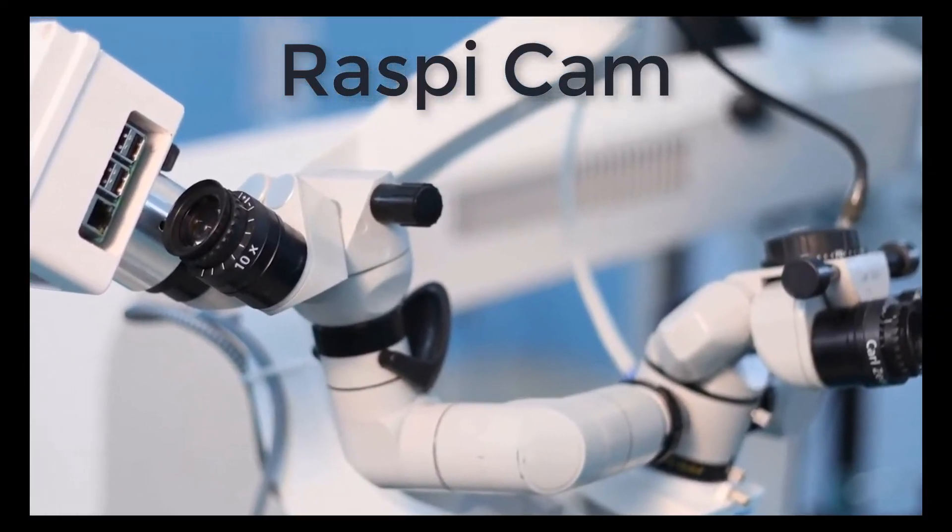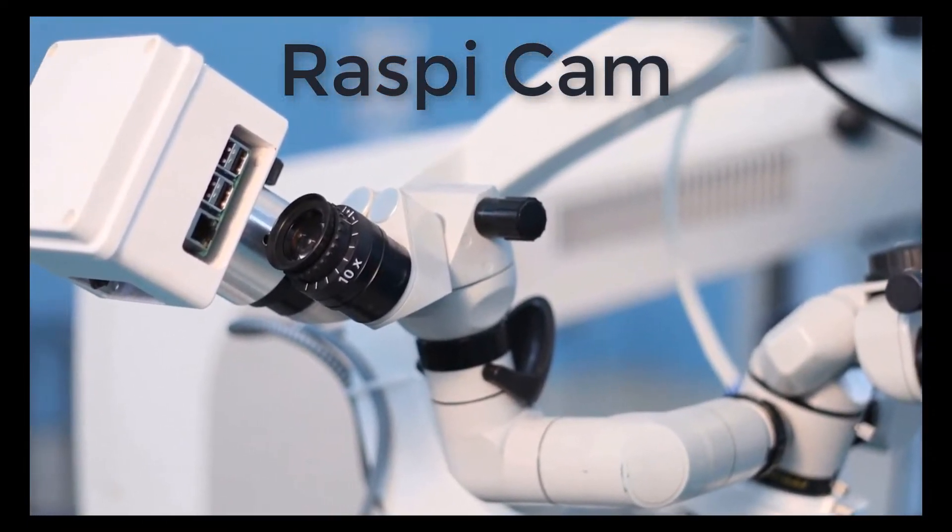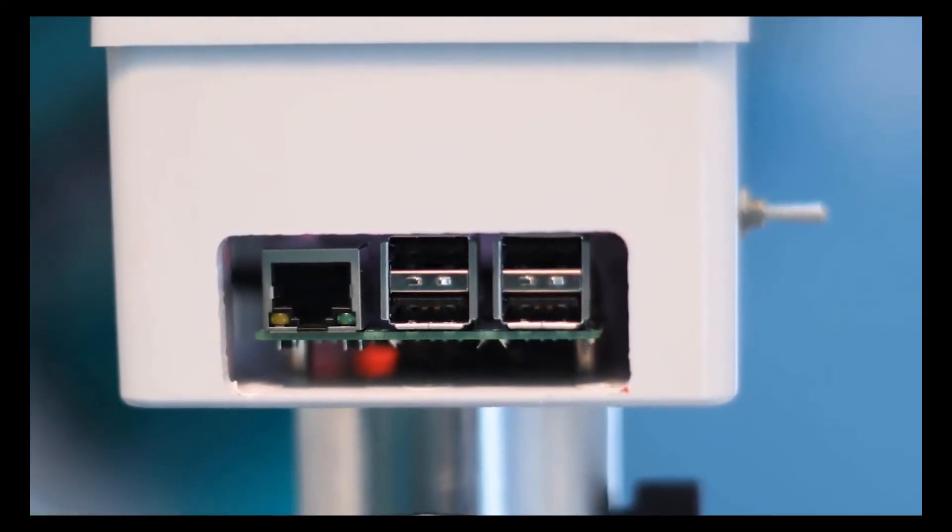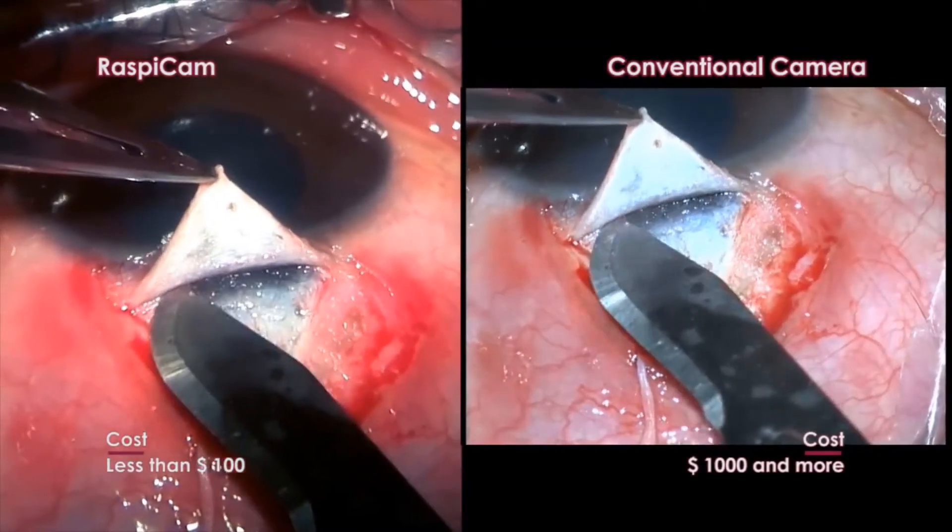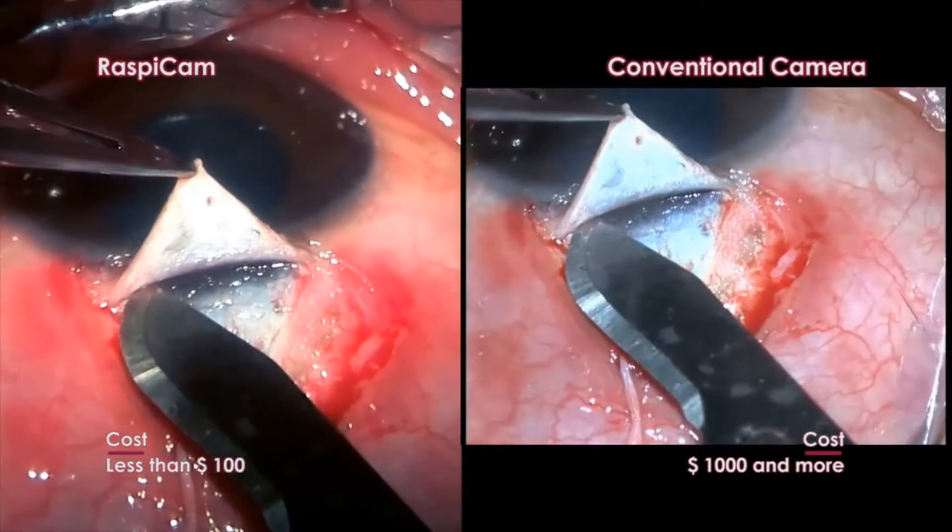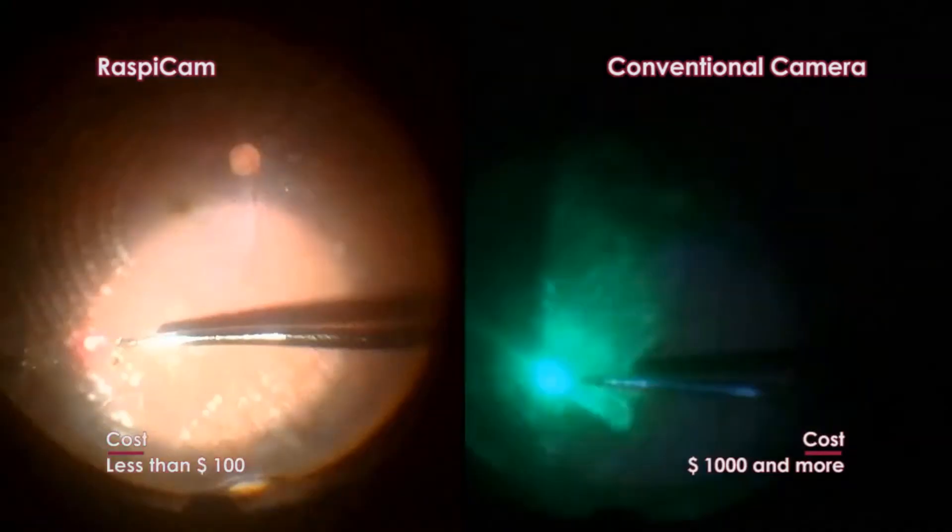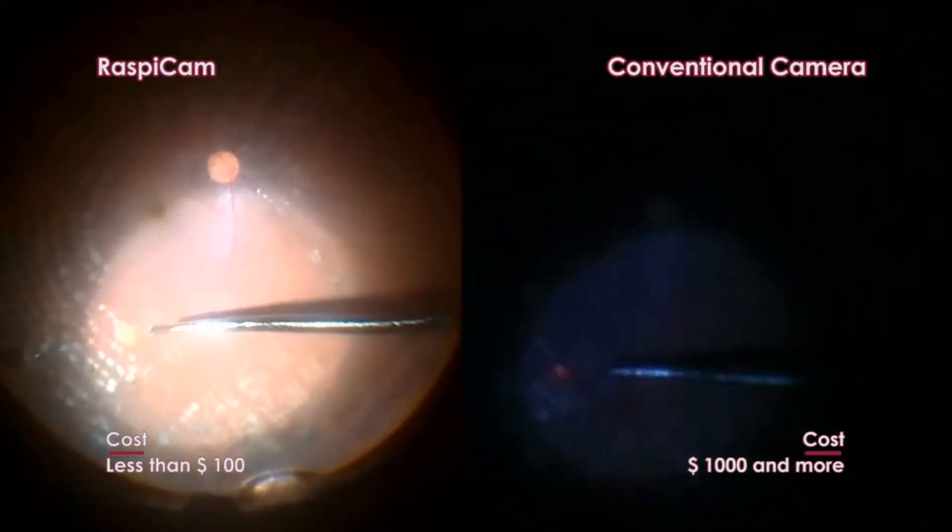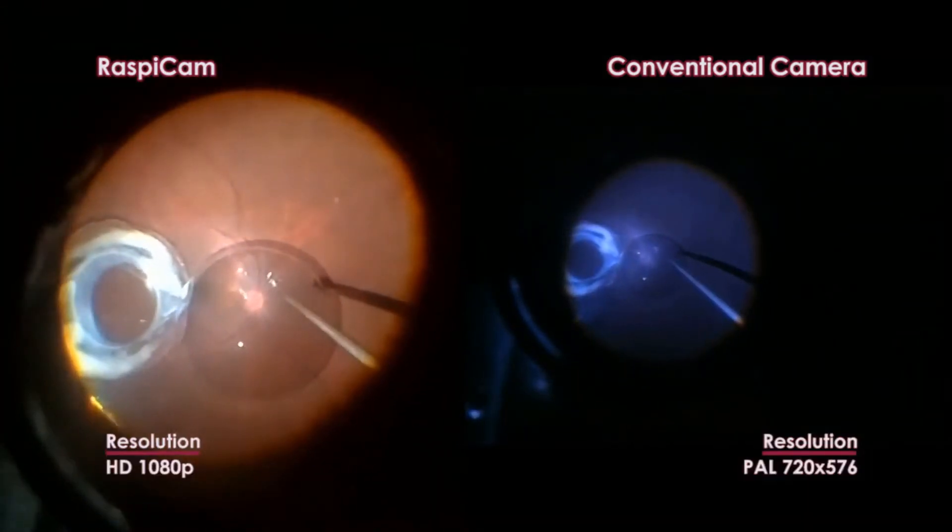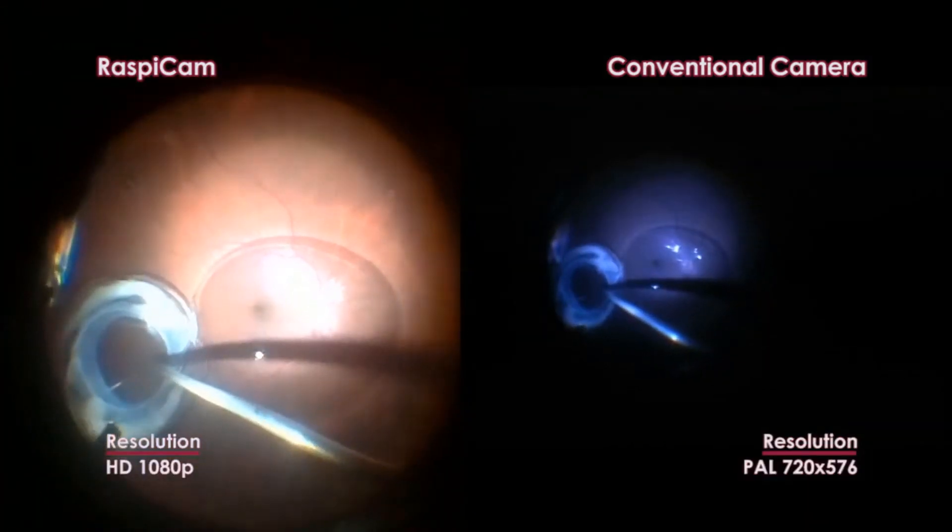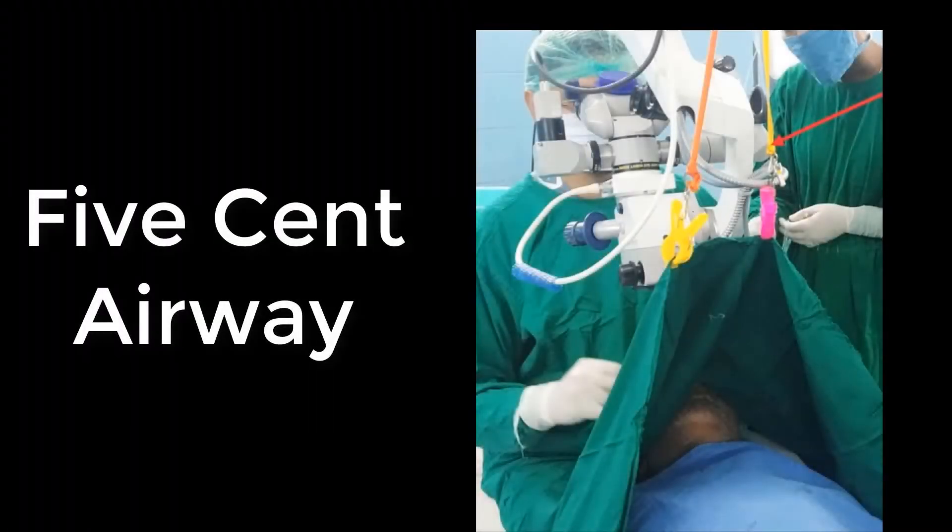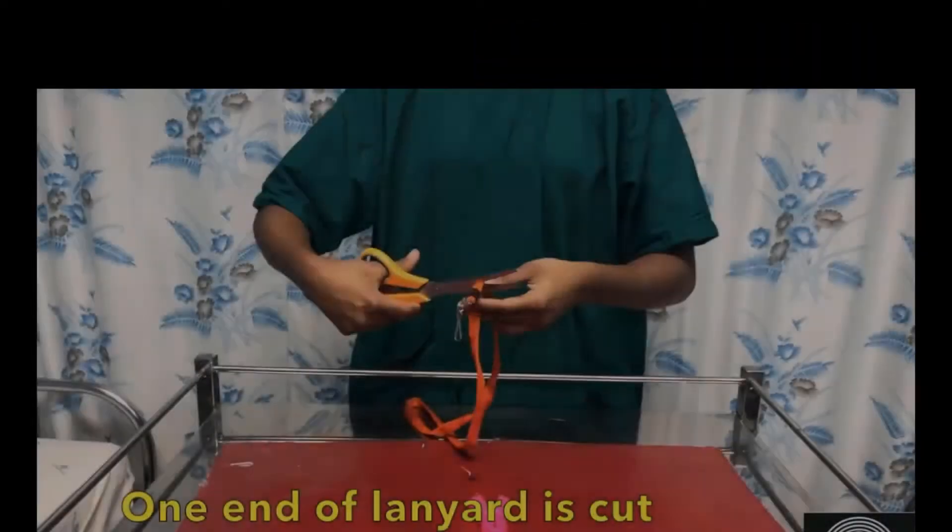Low Cost High Definition Raspberry Cam. Raspberry Pi camera is a fully functional Linux-based computer that can be fitted with a HD camera module. An adapter which is portable and also small enough to mount the Raspberry Pi can be fitted to the observer eyepiece. It has better quality than more expensive commercially available systems, is more portable, and records videos in high resolution.